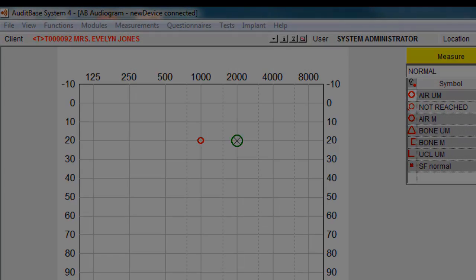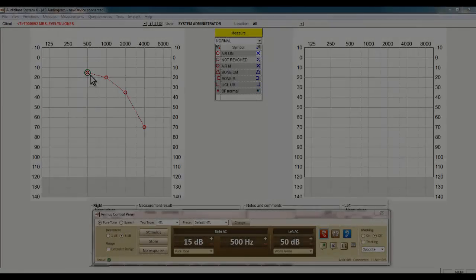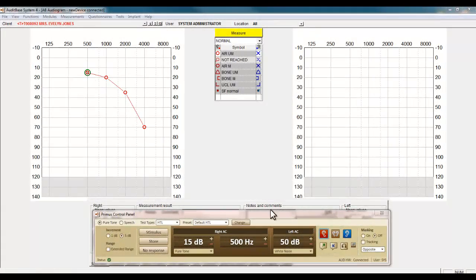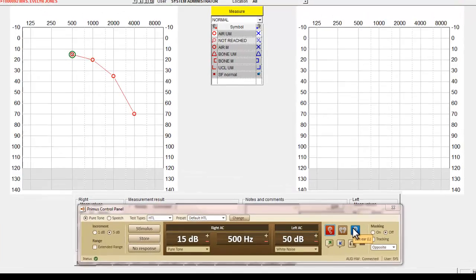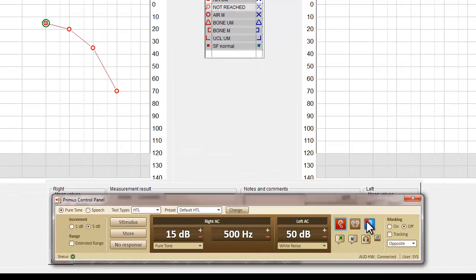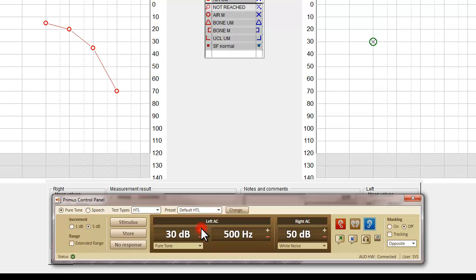With air conduction now complete on the right ear, we can move on to the left. During this demonstration, we are just using four frequencies to complete the test. All the usual frequencies are available to you; we have used just four frequencies for demonstration purposes.